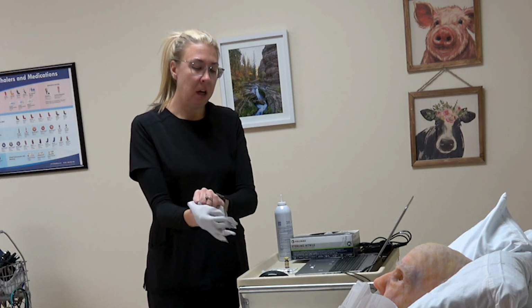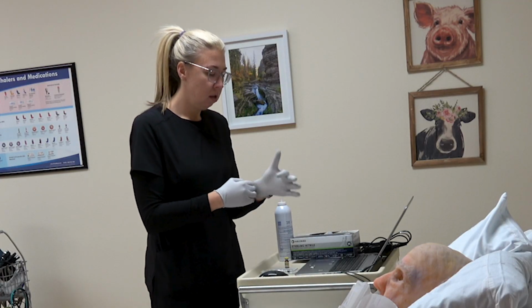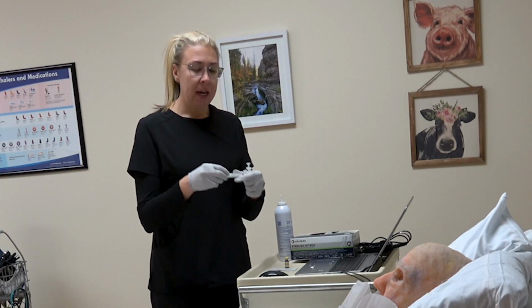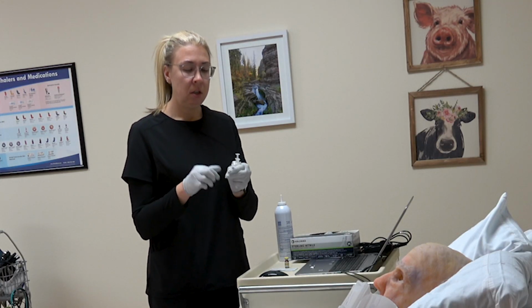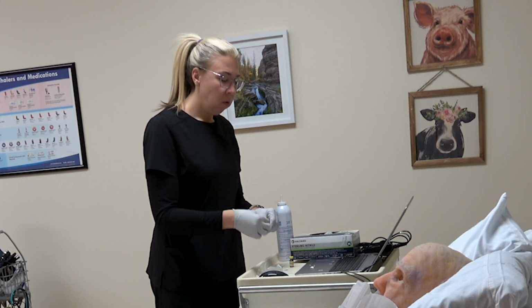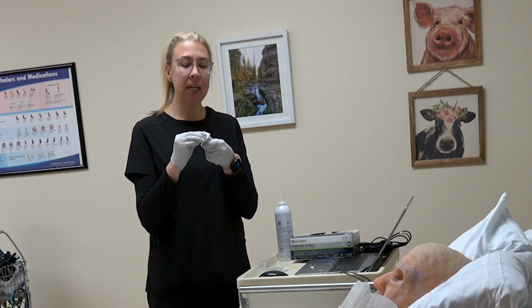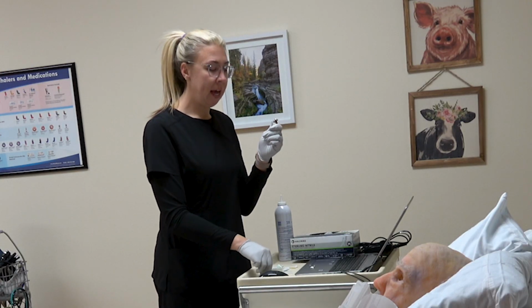I'm going to go ahead and put on my gloves to draw this up. So right now I have my syringe. I'm going to go ahead and open that up aseptically. And I have my needleless cannula that I'm going to hook up to my syringe. Just open the tops there. We'll go ahead and connect those. Okay. Now I'm going to take an alcohol pad, open that up. We're going to flip off the top of our medication, and we're going to clean the top of our medication for 5 to 15 seconds using friction. We'll allow that to air dry.